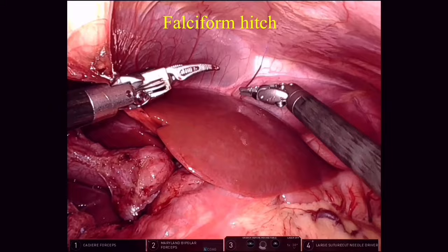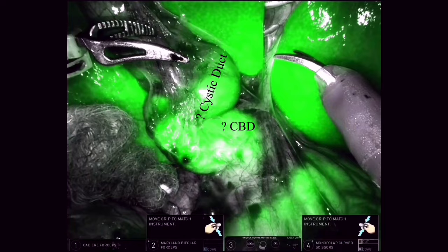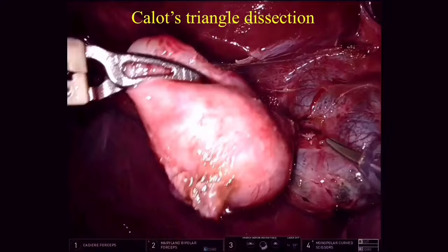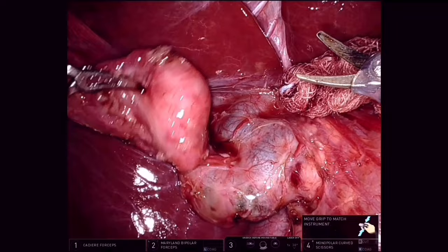The first step in surgery is to take a falciform hitch to retract the liver, then a gallbladder hitch to retract the gallbladder and the right lobe of liver towards the diaphragm. We use ICG on entry to see what appears like a dilated cystic duct and the dilated common bile duct. We start dissecting in the Calot's triangle. ICG is used and we see that the cystic duct is dilated and tortuous, and we can see a dilated common hepatic duct joining the cystic duct to form the common bile duct. We yet cannot see the aberrant duct seen on MRCP.